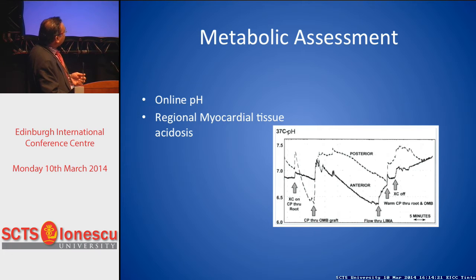And when the flow through the LIMA, in this case, is started, you can see the acidosis decreasing. So this technique also can give you information about the adequacy of the graft.